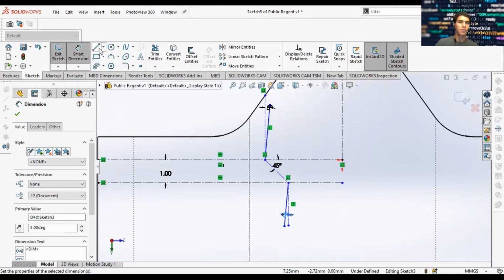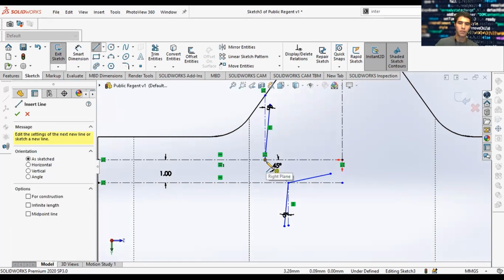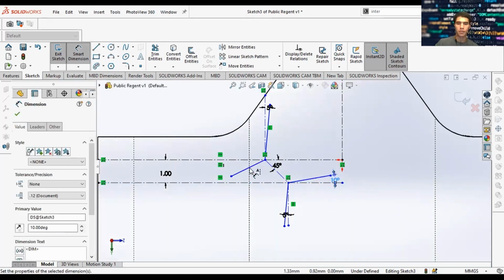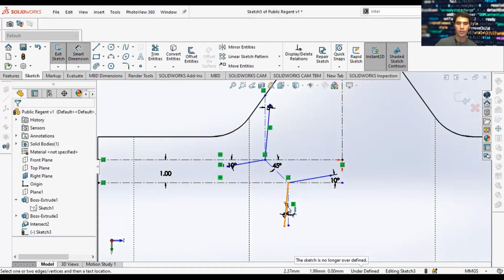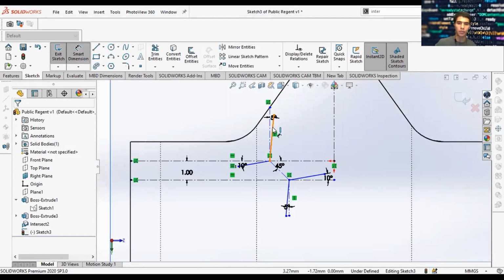Cool. So now we'll draw another one. And we'll put 10 on this, and then 10 on this one. And let's make that straight. About this one. And that's also very cool. So now what we'll do is we can set all of these equal to each other.